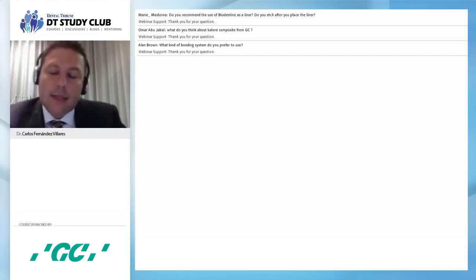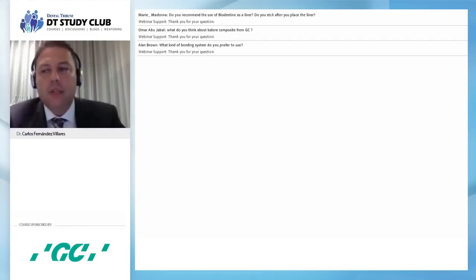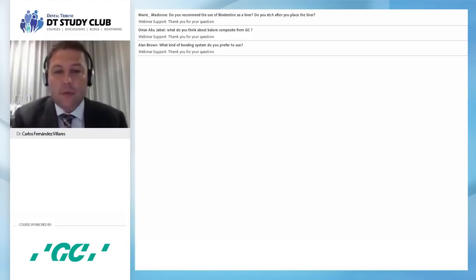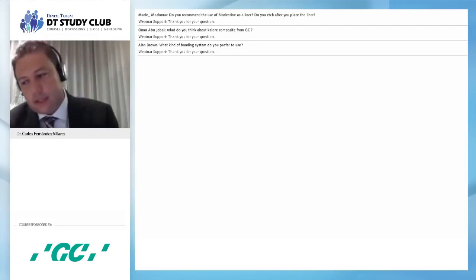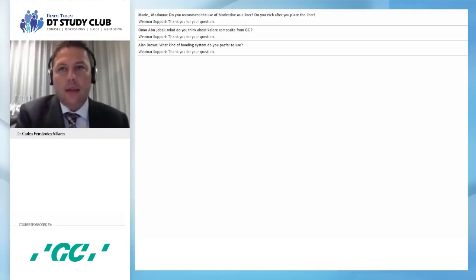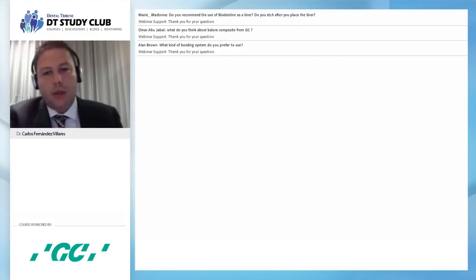But as I said during the lecture, the most important thing for me is to know the material I'm using and try to use it in the best way. So I don't care if I use a two-step system or a three-step system. I try to follow the steps to obtain the best from the system that I use. But if I have to make a summary, I would always use a universal self-etching system in the posteriors, and in anteriors I would use etching and primer and bonding in a separate way.